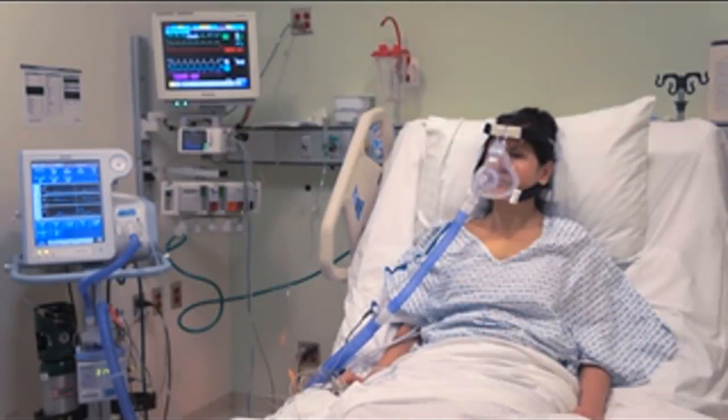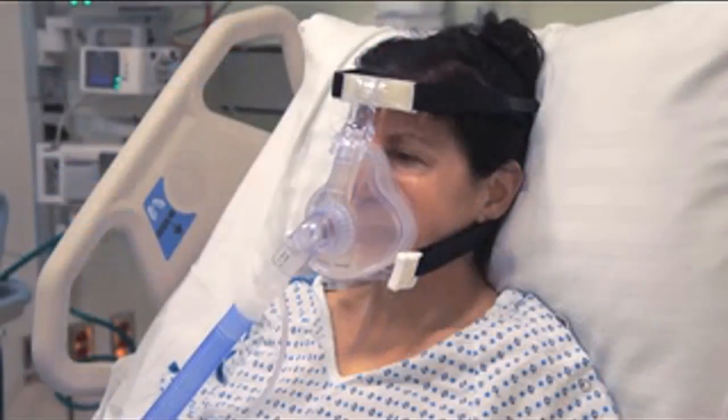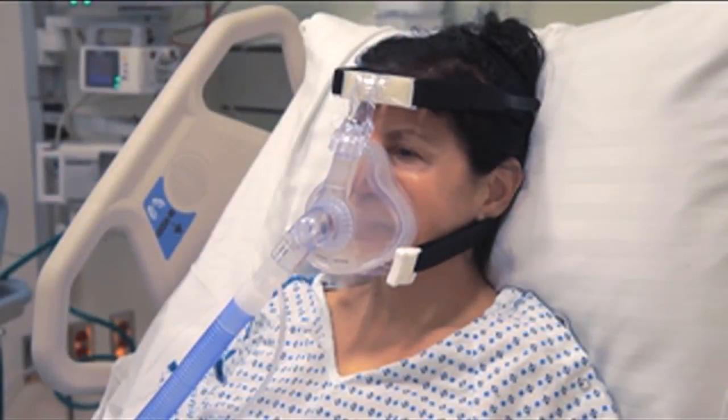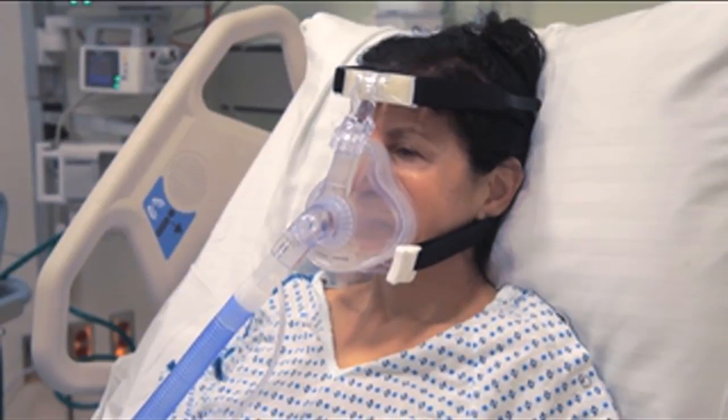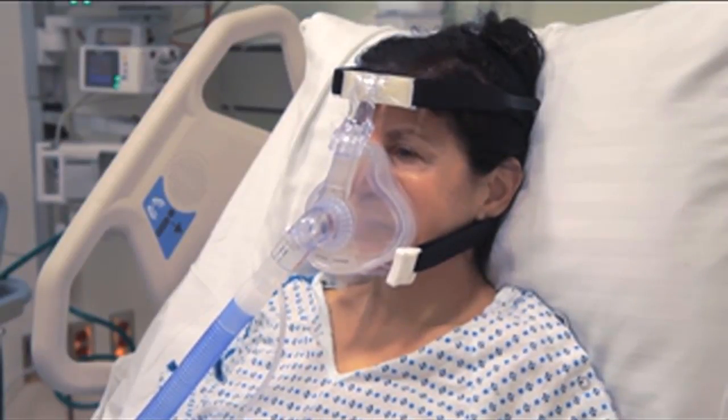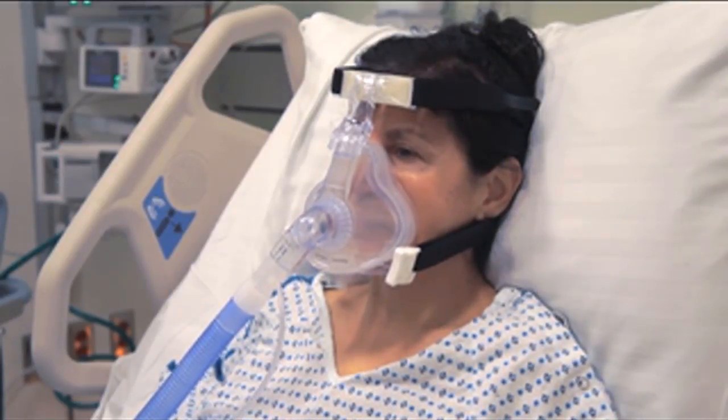The defining feature of BPAP and CPAP is the interface between the patient and ventilator that provides non-invasive airway access. In most cases, this interface is a mask. Many types of masks are available, but in urgent care situations, the oronasal mask is most common.